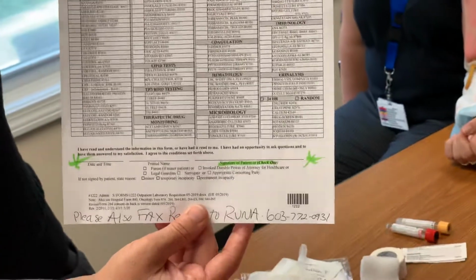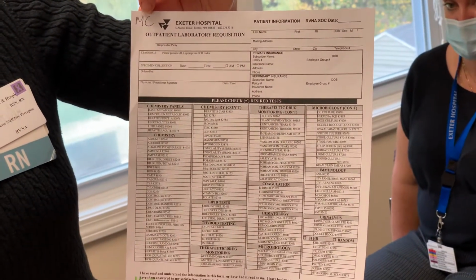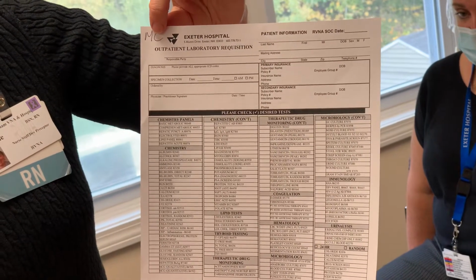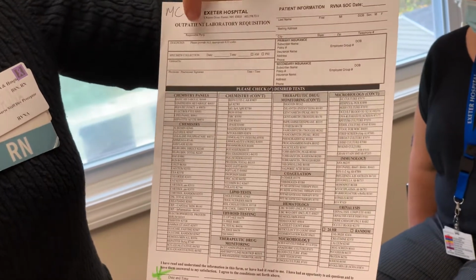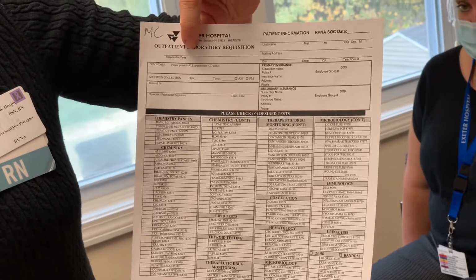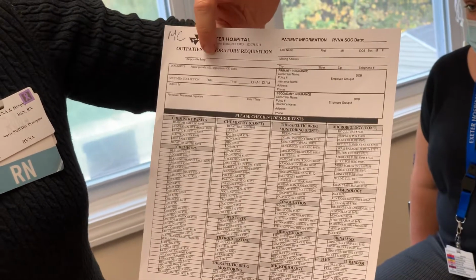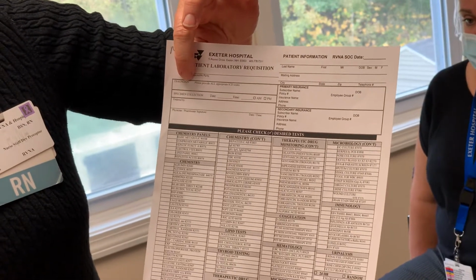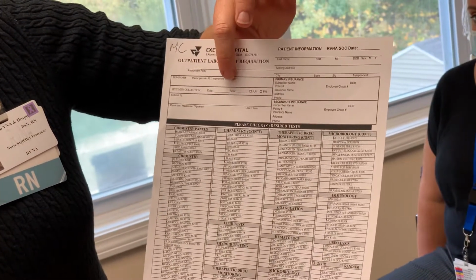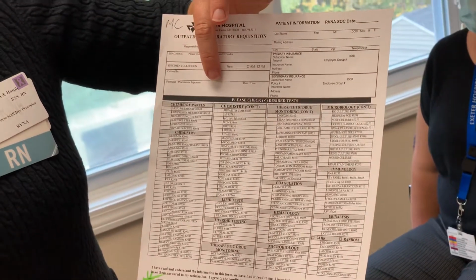So I know you guys are familiar with this. Always remember though to put your initial at the top of the form to indicate that you are drawing. That initial will also be on your specimen once you've drawn it. Make sure here when you're indicating which physician you want the results to go to that you are writing the first and last name. That is the responsible party. Any diagnoses, this is the code, the numbers and letters, not actually writing the diagnosis. The fax number of the physician that you want these to go to.